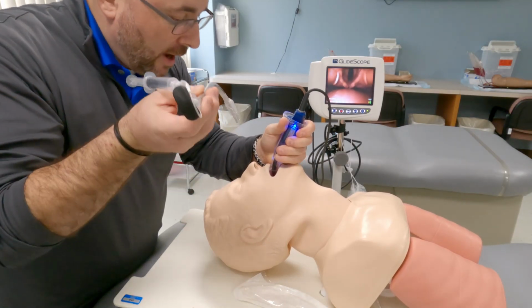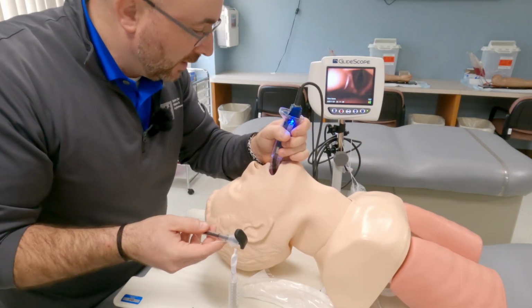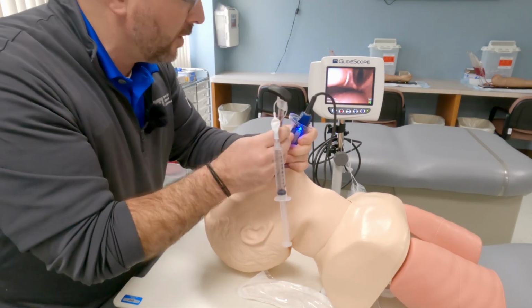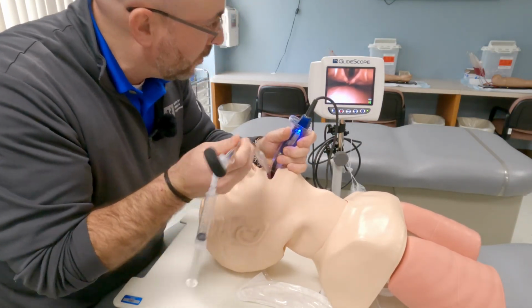Second one in, I'm going to look at the mouth again. So I'm looking at the mouth, I'm lifting, I see it, look at the monitor. Look back at the mouth, insert this, look back at the monitor. If you're looking at the monitor while you're trying to insert this tube in up here, you might have trouble.